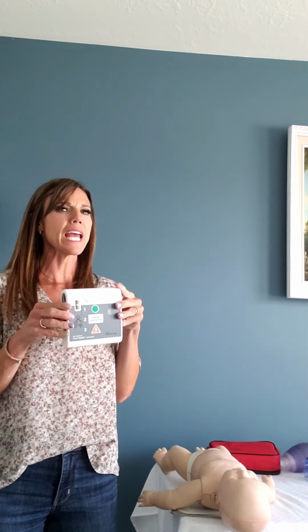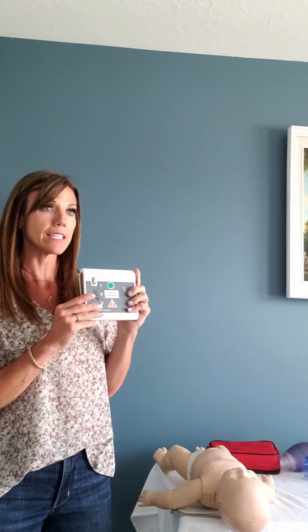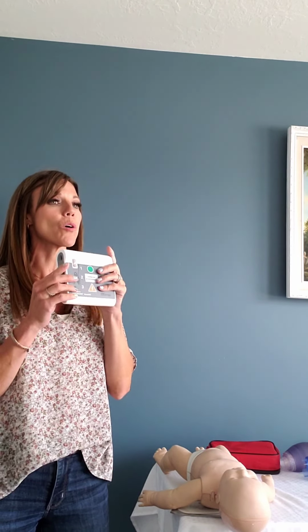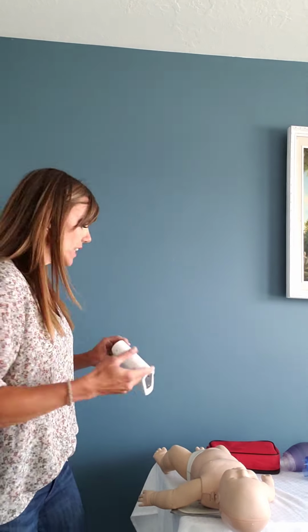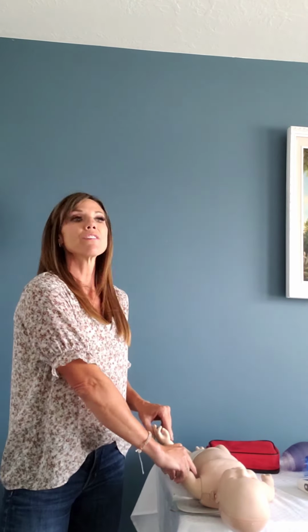Now, sometimes we'll put the AED on and it won't be a shockable rhythm. It will say no shock advised. If that's the case, they still could be dead. It could just be more that asystole or a rhythm that's not shockable. So if the AED says no shock advised, continue CPR if needed, it means you need to check for a pulse. Feel for a pulse.